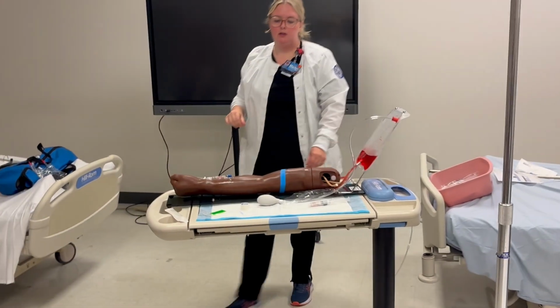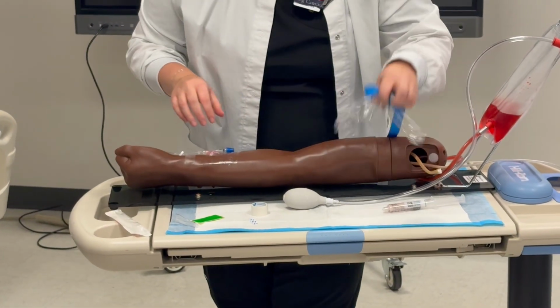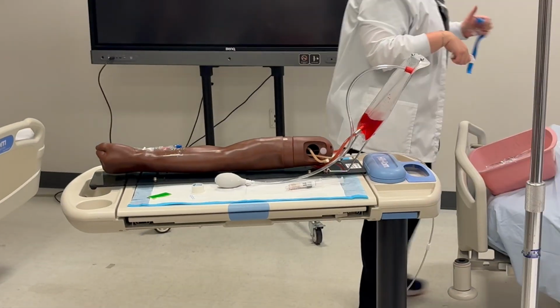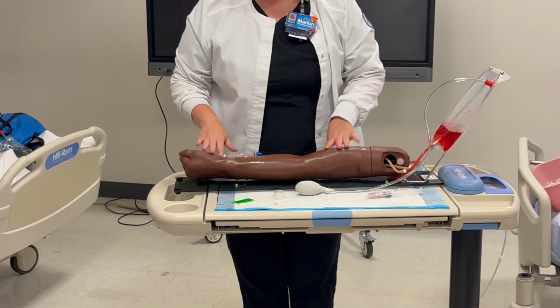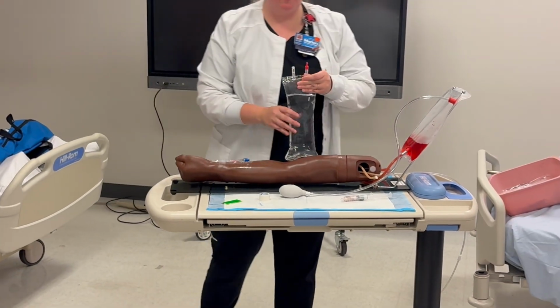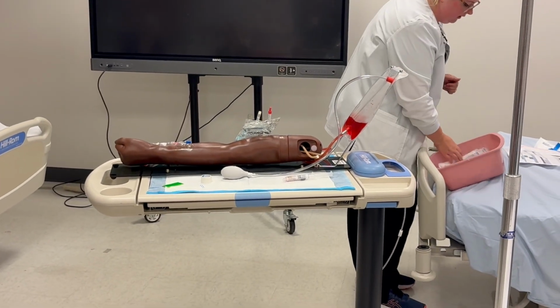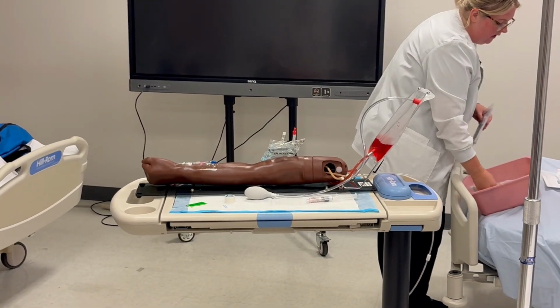Okay. Tourniquet can come off, we're done with that. Your tape you guys will probably run out of from practicing at home. Just let me know and I can replace your tape. Okay. All my other stuff is out of the way. Okay, Mr. Smith, your IV's in. Now we're gonna do your medication. So we're gonna start with our primary tubing, okay? Our primary bag and our primary tubing. So we can do our third medication check now.